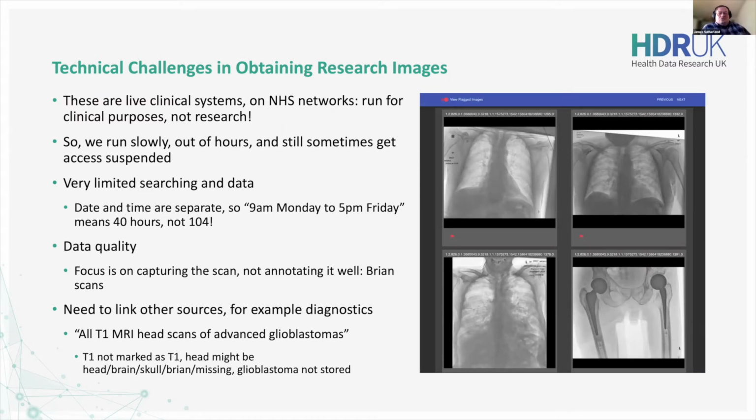Now, moving on to all the technical challenges of doing this for research purposes. The first one is not so much a technical problem, more of an organizational one. When we talk to PACS, this is a live clinical system, and the systems it's on and the people running it do it for clinical purposes first and foremost, not for research purposes. So whenever we approach a bit of the NHS wanting data from PACS for research, it's not their top priority, and it's not necessarily even a priority. It can be something of an inconvenience to them, and they are understandably very concerned that we must make absolutely certain that whatever we do doesn't interfere with clinical usage.